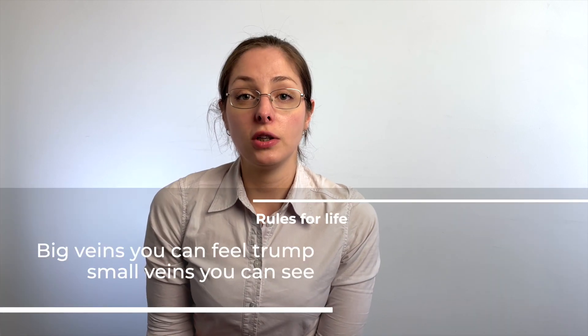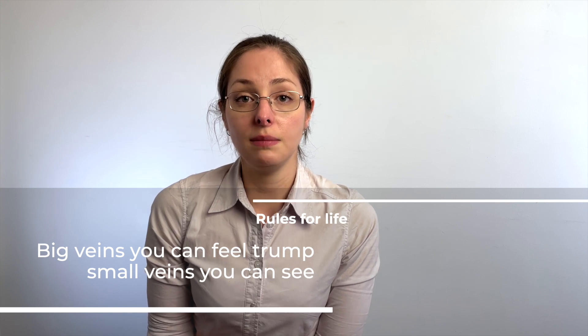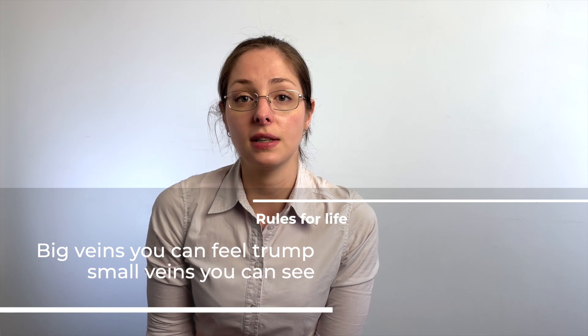It's really tempting to go for veins that we can see, just aiming for the blue, but actually the best veins are the ones you can feel. Make sure that your patient is in a good position and that you're comfortable as well. Take your time to pick a good vein. Try to avoid ones that have been used multiple times and have got signs of phlebitis or sclerosis - if the veins are scarred, they're probably going to be phlebosed or sclerosed.